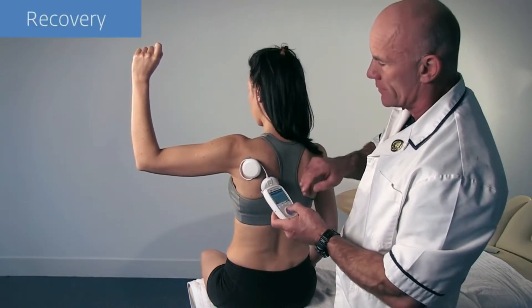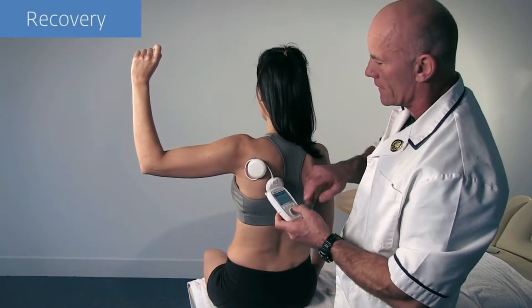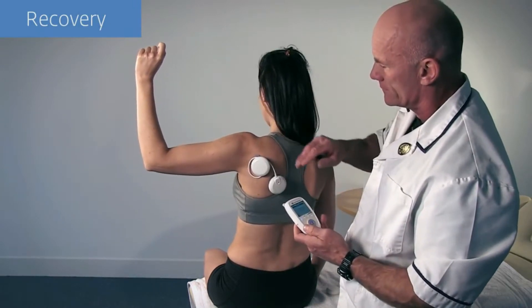After each work phase, a recovery phase is provided to ensure the quality of work is not compromised. The Mover's Factor is optimized.